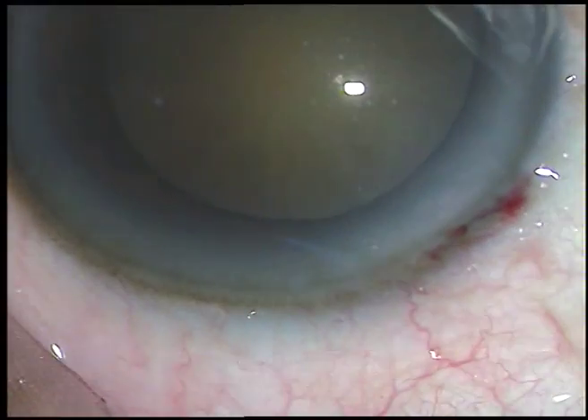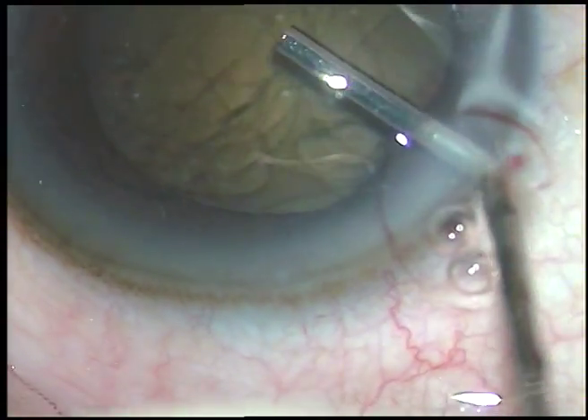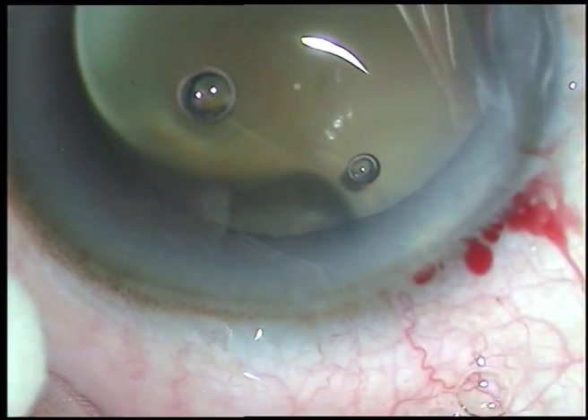This is the main incision. It's a 2.8 mm posterior limbal incision. As you can see there is oozing of blood from the incision site.